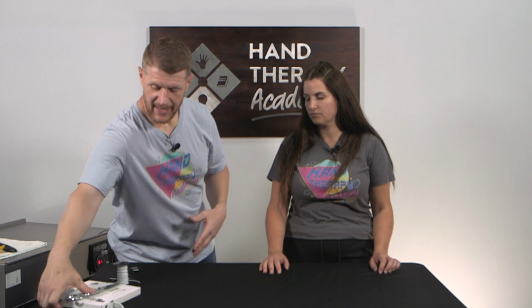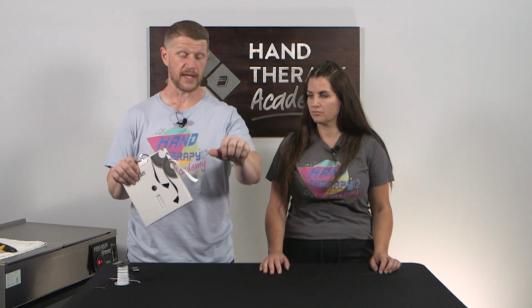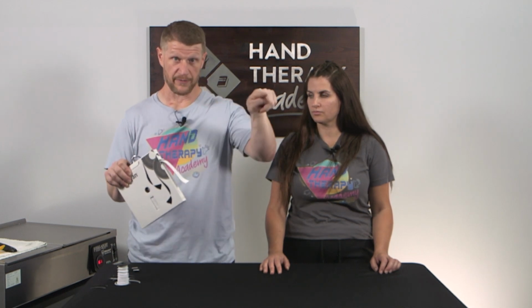And while that's getting ready, let's talk about some of our supplies we're going to need. I'm going to use a 1/2 inch wide elastic strap. Okay? Using this is softer. It doesn't have the hard factory edges of a normal strap that we would use, but also gives a little bit more give to the patient when they flex down, and that's going to loop around the fingers.